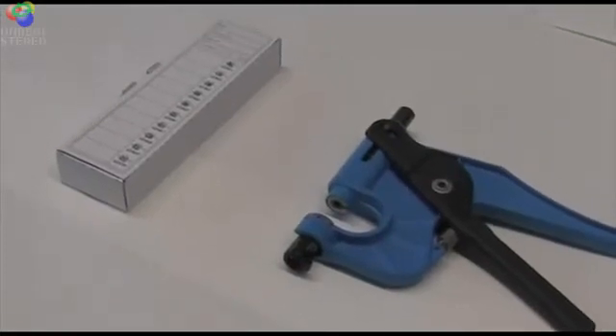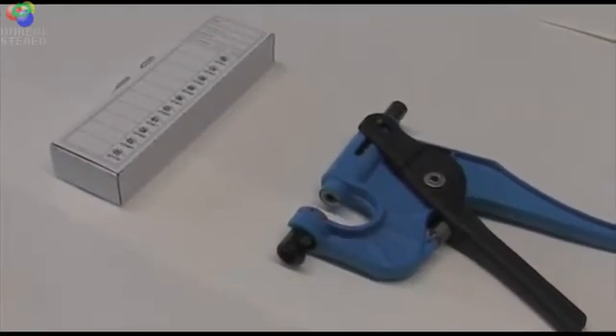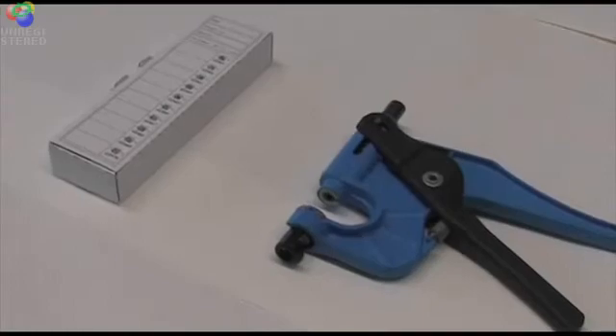To take a sample using the Allflex tissue sampling unit, you will require an Allflex applicator gun and a box of the Allflex punches.